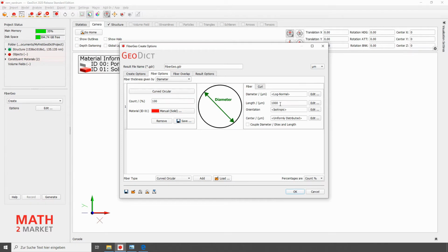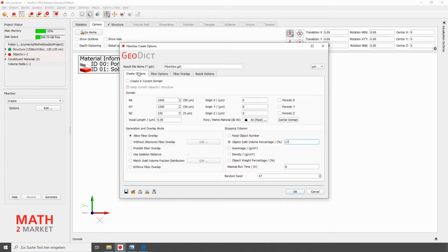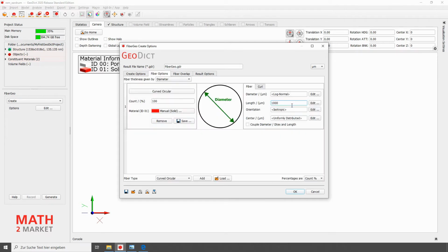Another parameter we still have to choose is the length. In our example, it is sufficient to choose a length that is greater than our domain. Since the domain we modeled is 50 micrometers, we choose a length of 100 micrometers for the fibers, so that, if possible, we have no beginning and end in our final fiber structure. The next parameter we can set is the orientation. For this, we have previously analyzed the orientation of the fibers.